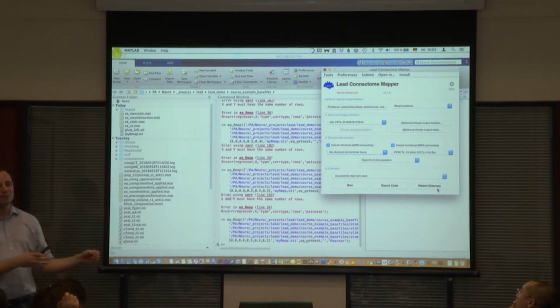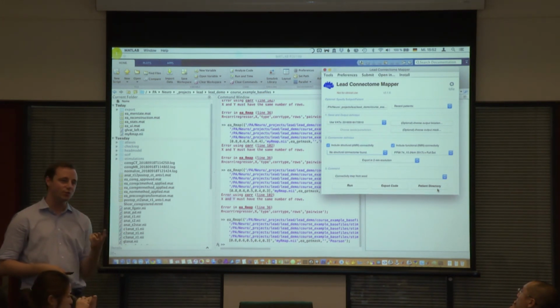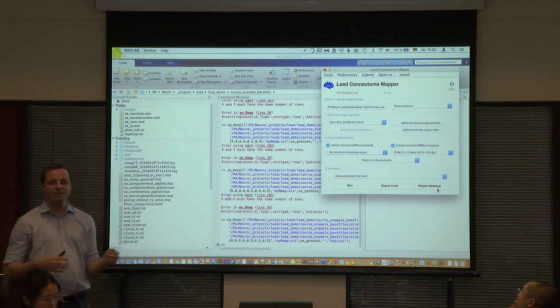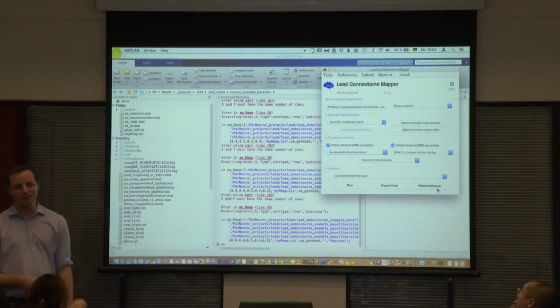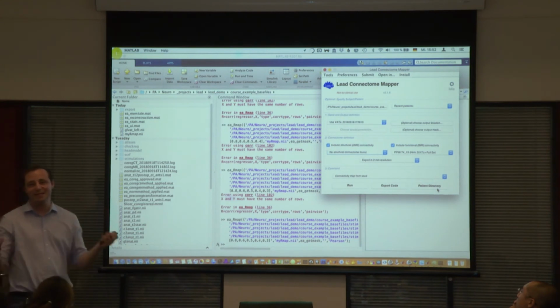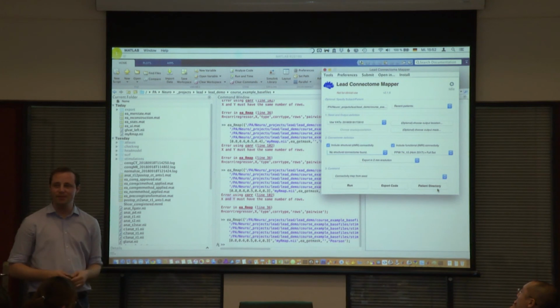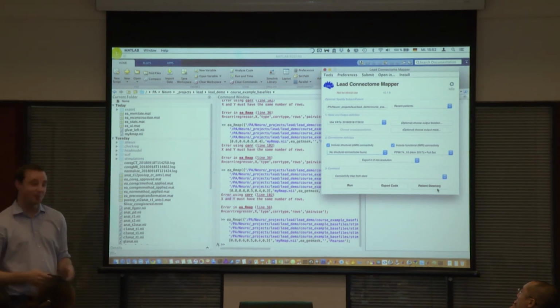And any of these tools can help to answer specific questions, but there's no Connectome button that can be used for everything, because you really have to question yourself, what is my specific question, what do I want to show? And if you need help and you can formulate such a question well, then we can tell you use that tool for it. Sometimes people approach us and say, I have this data set and I want to do connectomics with it, and then we say, okay, there's so many things that you can do, but you need a good hypothesis first, and then we might be able to help with a tool for it or not.